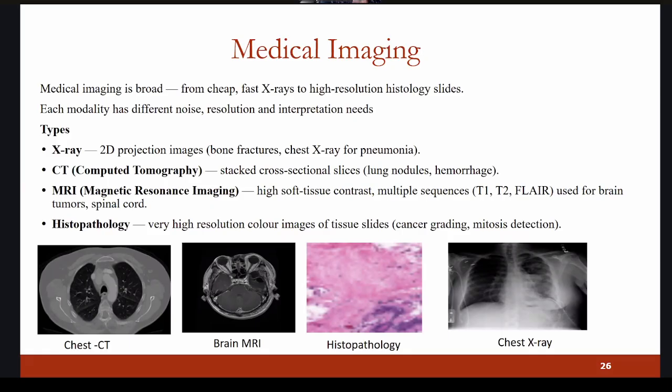People started working with X-ray images using all your deep convolution architectures, right? So I have taken only an X-ray bone fracture image as input, and I have trained the custom CNN model and other deep CNN architectures, and I'll show you what is the performance of those architectures, right?